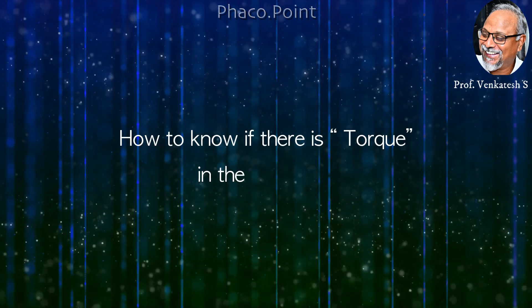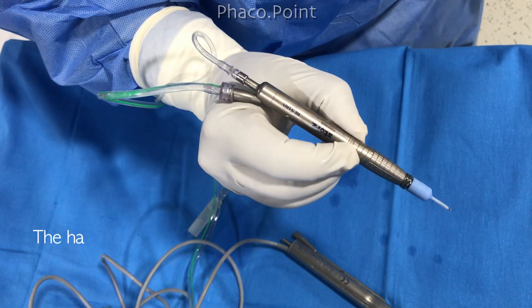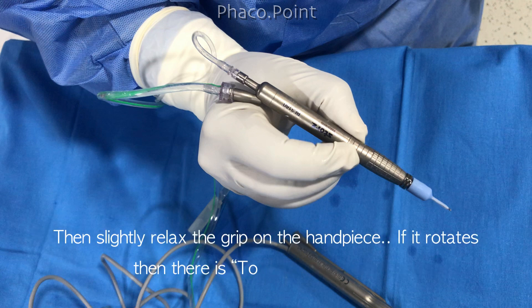Now how do we know if there is a torque in the tubing? There's a simple test. When we hold the phacoemulsification handpiece in a pen-like grip between thumb and index finger with the aspiration port facing upwards, and when you slightly relax the grip on the handpiece, it rotates — which means that there is torque.